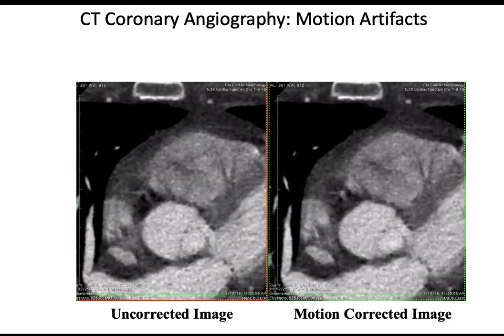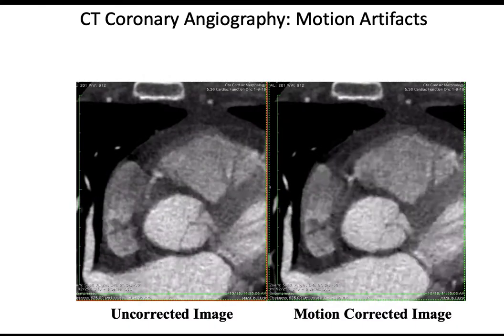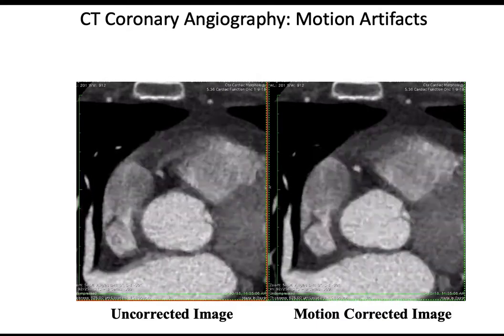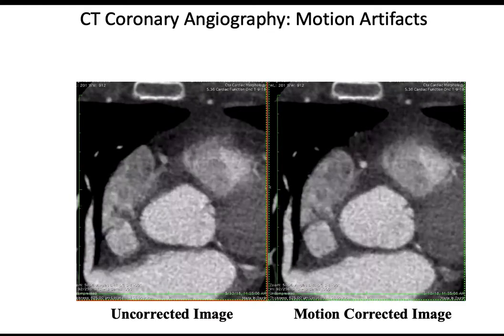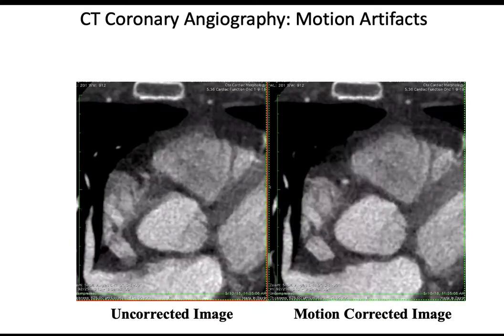So to make any one of these pictures, it's not sufficient to just have 180 degrees of the data. You now have to have a little more on either side. So instead of scanning for a second, you now maybe pay a 30% penalty. Instead of 8 times higher, you pay 30% more. You get these extra views, but you can increase the number of readable scans. And so you're trying to embed more information into the reading.